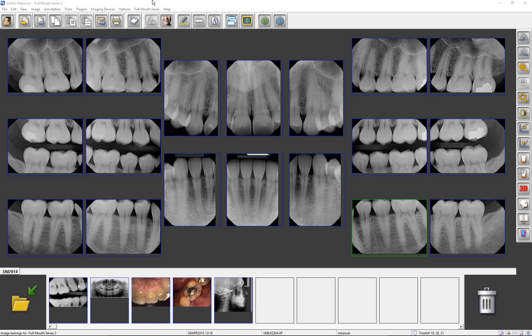Welcome to a Gendex video training series that demonstrates the functionality of VixWin Platinum 3.5 imaging software. This tutorial will show you how to use VixWin's image enhancement tools when analyzing X-ray images. Image treatments are accessible in several places of the interface, depending upon your preferences and needs.